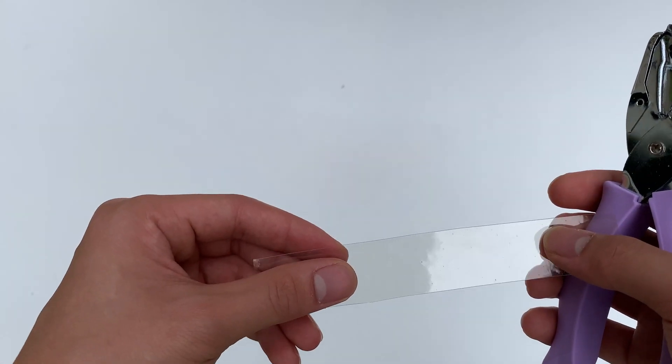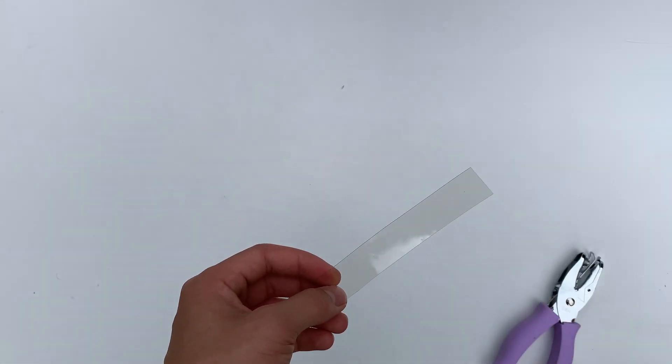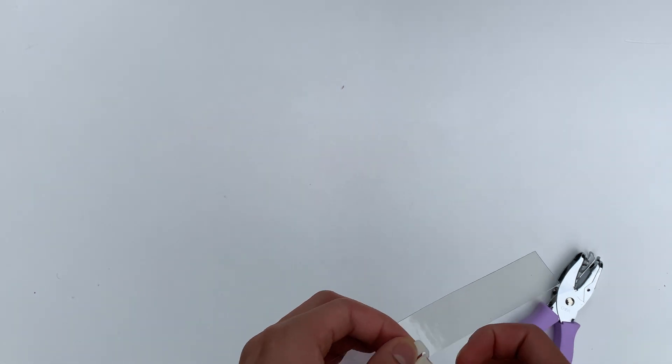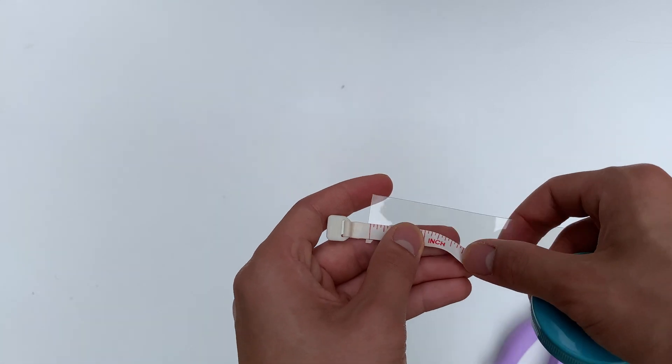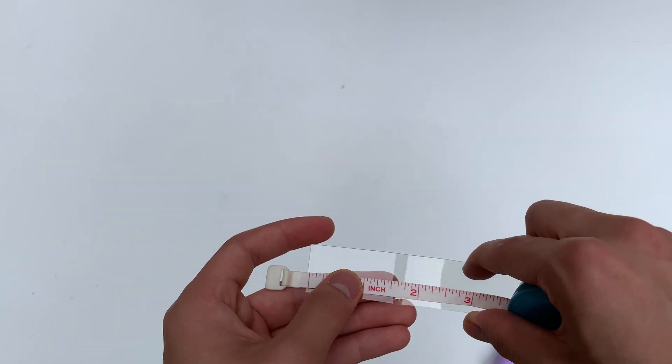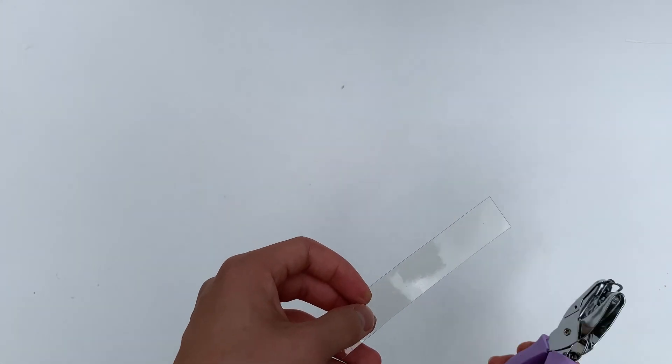Get a hole puncher if you can and punch holes along the center of the plastic strip. This is optional. The holes will make breathing only slightly easier, and it is not as important. Leave around one inch at the bottom of the plastic strip without any hole punches, because this will be in contact with your chin, and holes will be irritating even if it is on the smooth side.